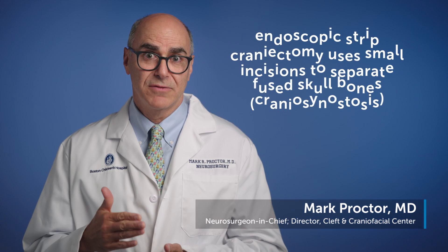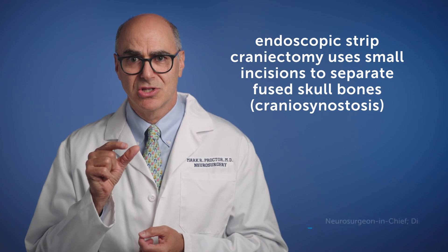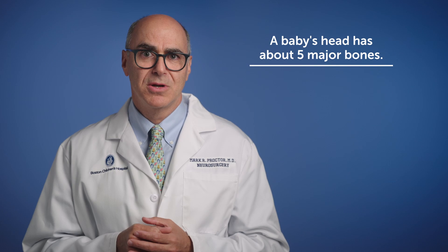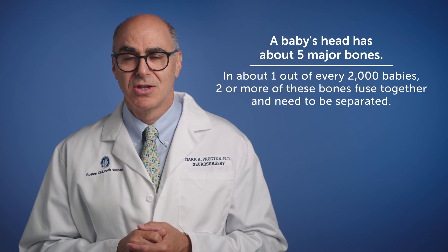Endoscopic strip craniectomy is a relatively newer way of treating synostosis in which we use small incisions to separate fused skull bones. In the normal course of events, a baby's head is made of about five separate major bones, but in one in about every 2,000 babies, two or more of those bones fuse together. With the endoscopic strip craniectomy, we can separate those bones in a very small operation.